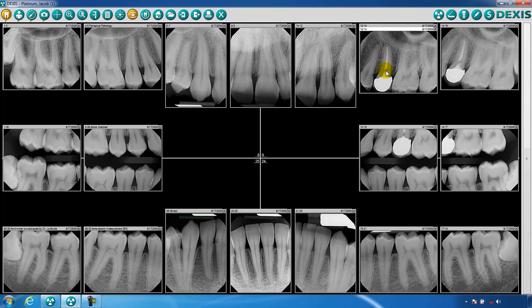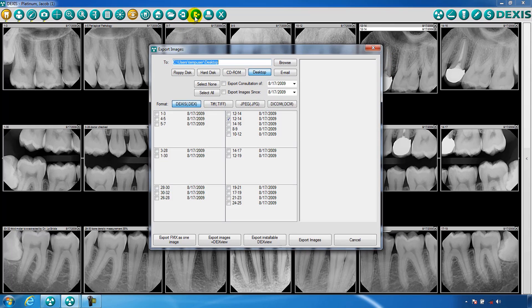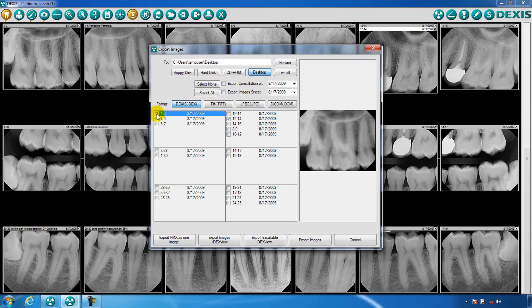The next tool is used to export images. Export allows you to select images that you would like to share or remove using several options and formats.